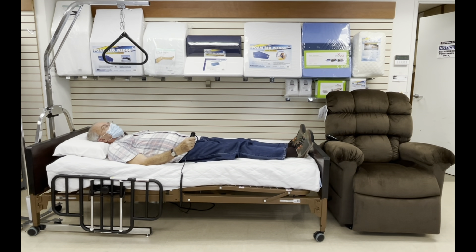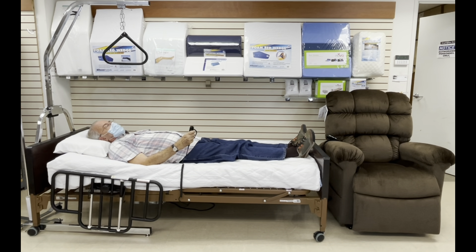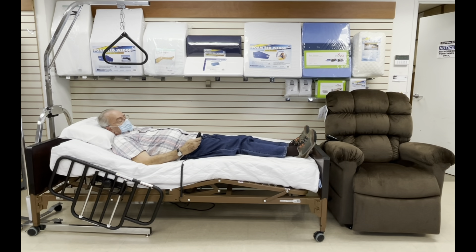Pressing the following two buttons will either raise the head and the knee of the bed, or will lower the head and the knee of the bed simultaneously.